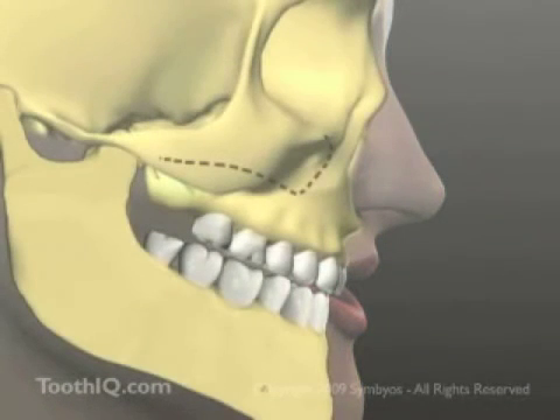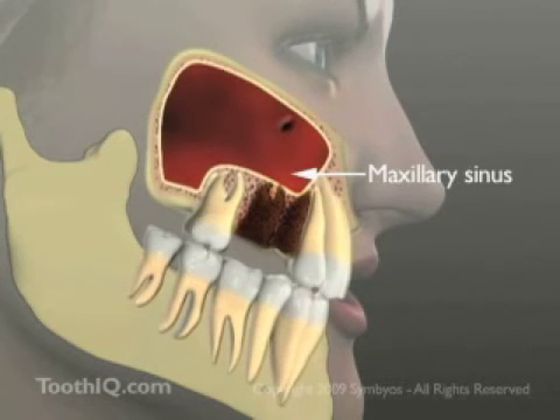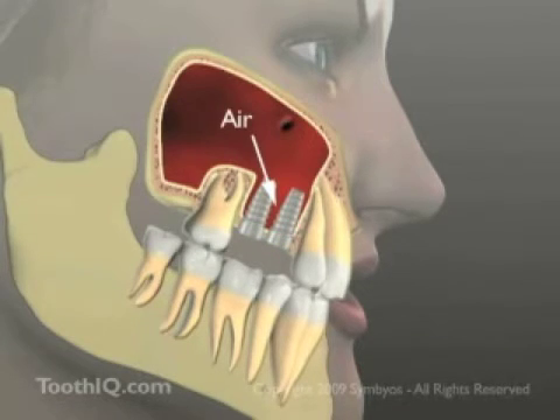This is a hollow air chamber inside the upper jawbone, or maxilla, beneath the cheekbones. When upper teeth are lost, the tooth sockets fill in with bone over a few months' time. However, the bone soon begins to dissolve or resorb as the floor of the sinus remodels downward. Unless the lost bone is replaced, dental implants are not an option because there's no bone left to stabilize them.